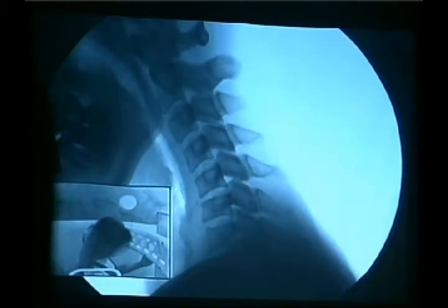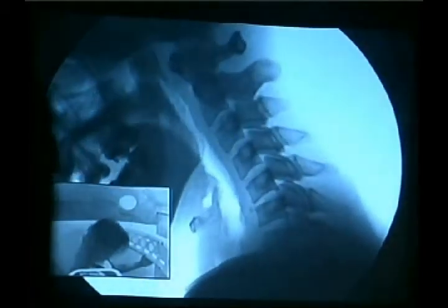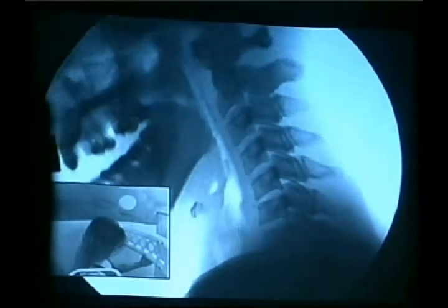Now, we did one other thing with this technology, because the lawyers always said, why can't I see my client? State Farm thinks you guys are throwing x-rays at me of someone else. So we added a picture-in-picture board, so we digitally look at your patient on the outside. So we see Susie here, and we're looking inside simultaneously. It becomes alive. Everybody loves watching movies today. We send this to the insurance adjusters. They go nuts. It scares the heck out of them, and they just want to settle.